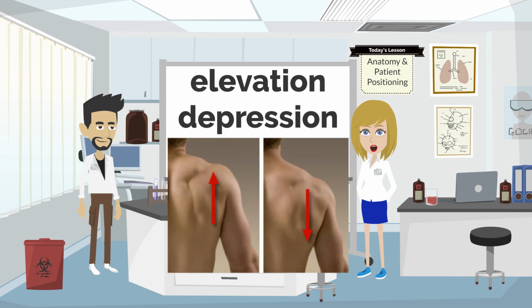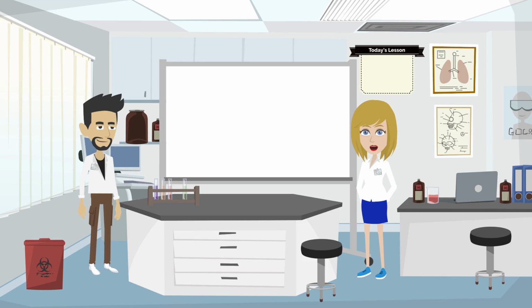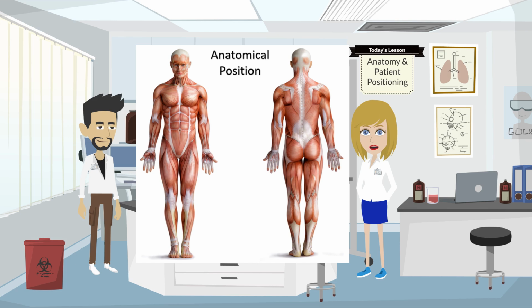Elevation moves a part of the body up or superior. Depression, the opposite of elevation, moves a part of the body down or inferior. When discussing radiographic positioning, know what to do when placing the body in the proper position to create the best X-ray you can. Giving patients correct positioning instructions requires the inclusion of terms that describe the relationship of body parts and the location and orientation of body structures in place.